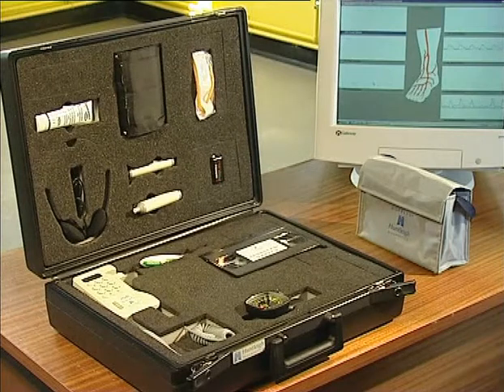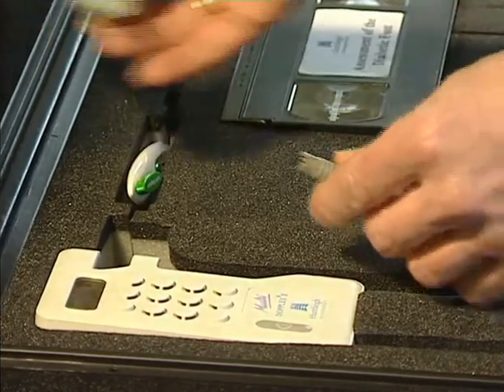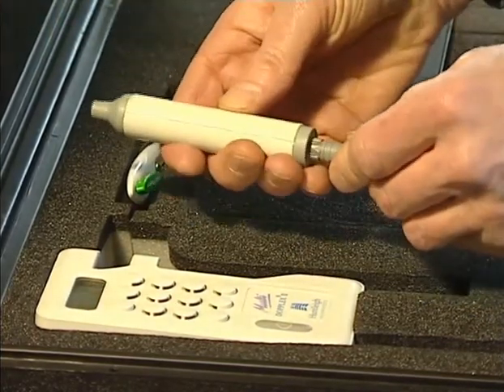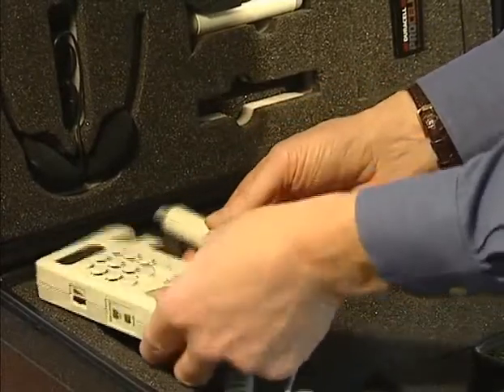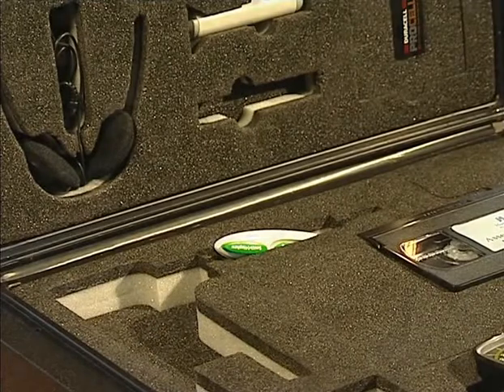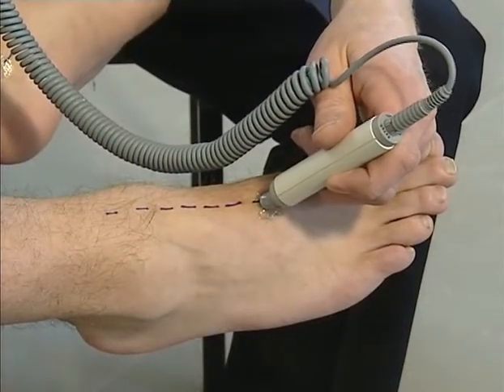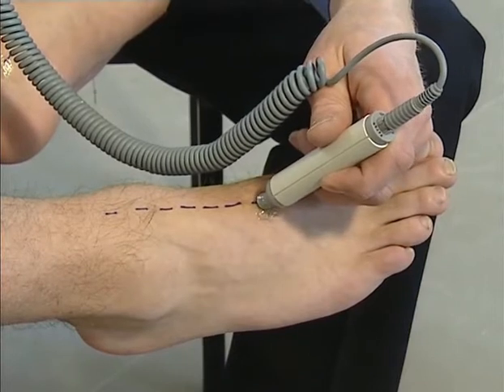The use of a handheld Doppler can be invaluable in these situations, and we would stress that if you have a Doppler, it should be used routinely. This will give you more information than just feeling a pulse with your fingers. Now let's have a look at a handheld Doppler being used on a normal foot.